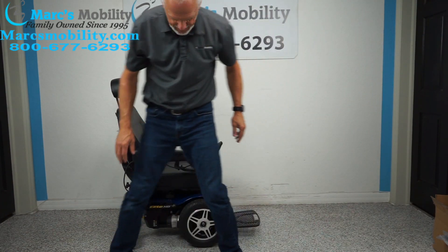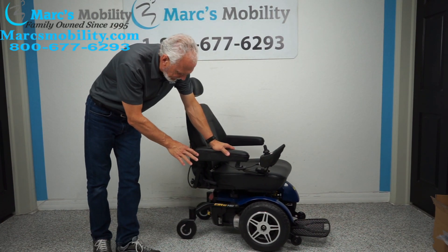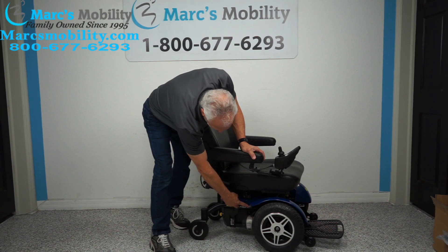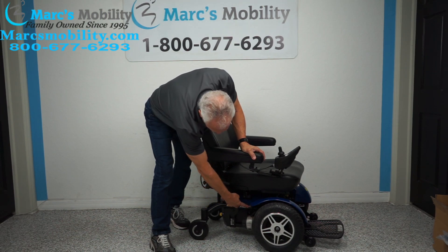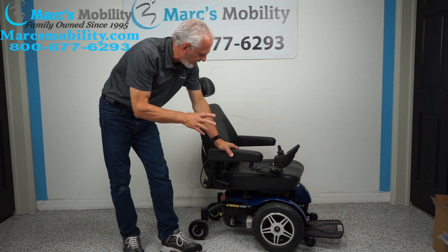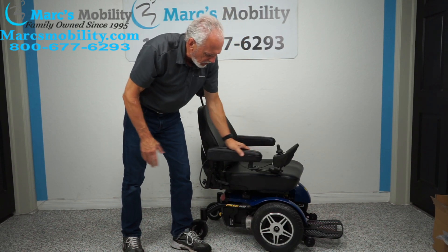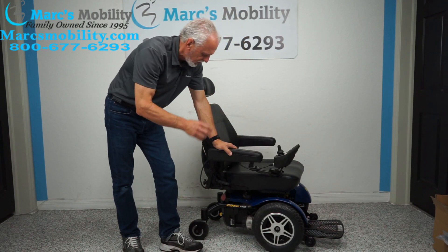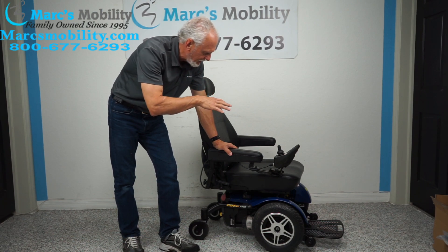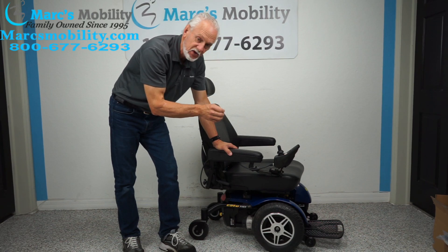So this is a Jazzy Elite HD with a 450 pound weight capability. Your reset button is right above where it says Elite HD. The seat is 21 by 21, it has flip up arms, solid tires — just a really nice heavy duty power chair. If you need something not too big and something pretty basic, this one would definitely do the job.